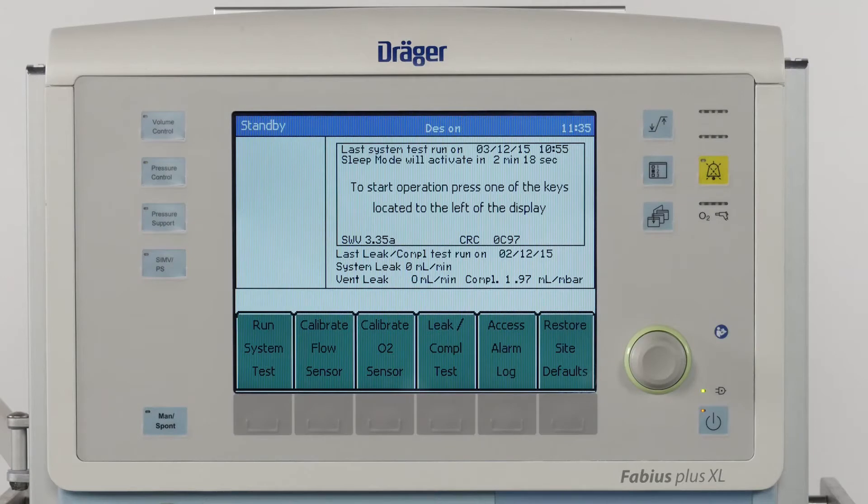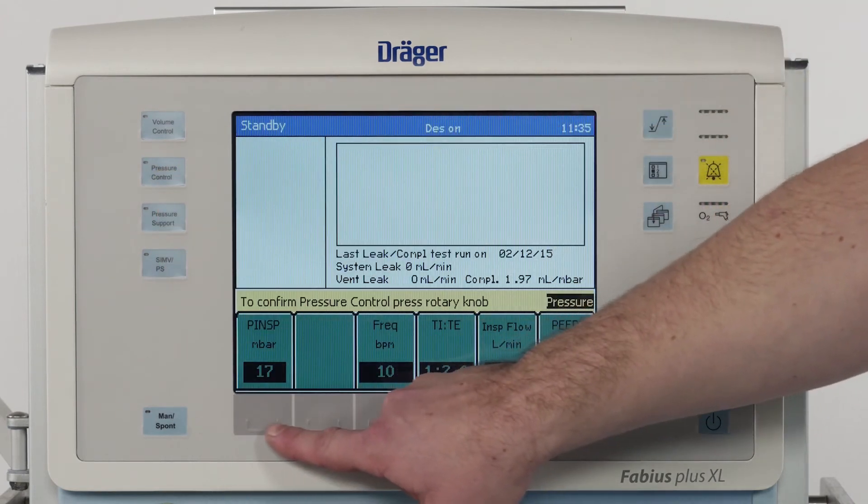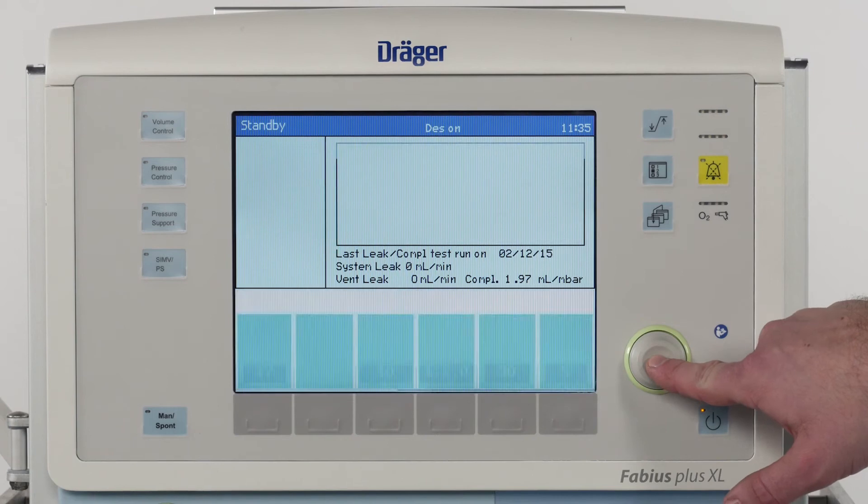When you want to switch to an automatic ventilation mode, for example pressure controlled ventilation, you simply press the key, adjust the ventilation parameters and confirm via the rotary knob.